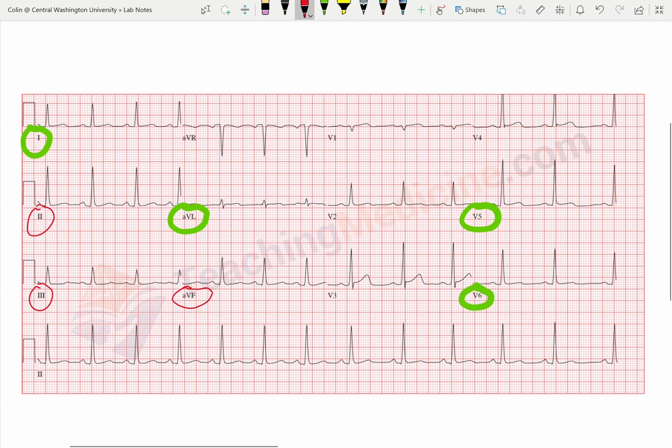And it's going to be really important that you tell the medics that when you show up and say, hey, here's the story, here's a set of vitals, here's what we did because of that, but he has gotten so much worse since we gave him the nitro. That's going to key me in to say he's probably having an inferior MI, and we'll throw the 12 lead on and try to diagnose that.